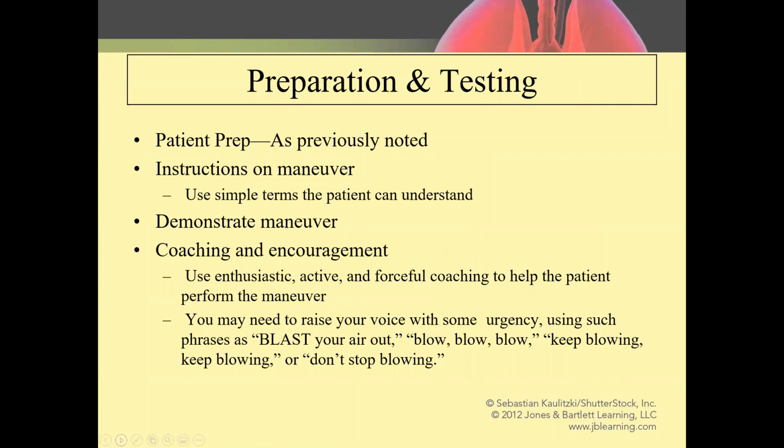Coaching and encouragement: use enthusiastic, active, forceful coaching. I don't know if that's their nice way of saying yelling, but they say don't yell, but forceful coaching to help the patient perform the maneuver. May need to raise your voice, some urgency, blast it out.